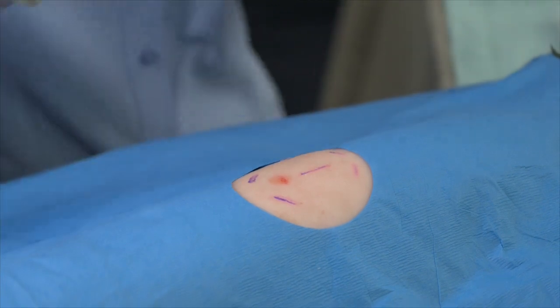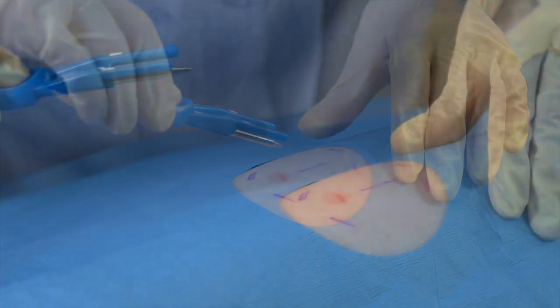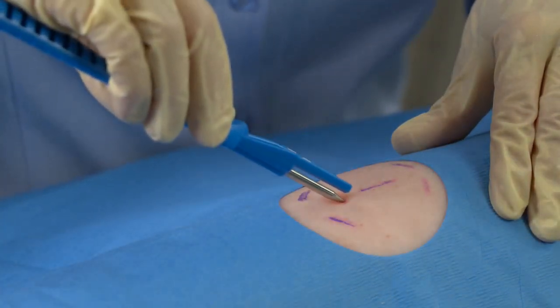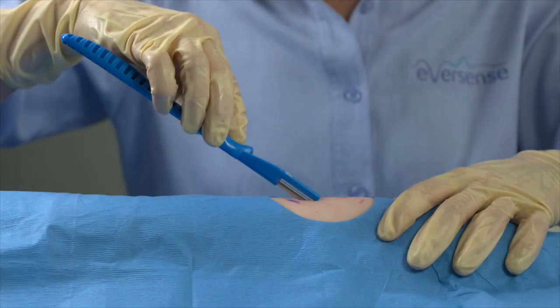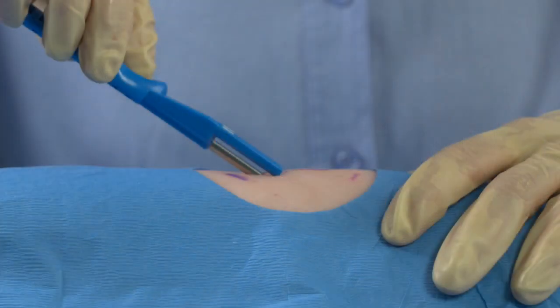Now remove the custom blunt dissector from the tray. Hold it with your dominant hand as shown. Ensure your fingers are not under the metal rod or plastic portion of the tool. Introduce the blunt dissector to the middle of the incision line at a 45-degree angle so that it follows the vertical line you drew for the sensor pocket path. Note that the tip and tapered portion of the blunt dissector should be within the incision, and the tips of the depth guards should make contact with the skin.